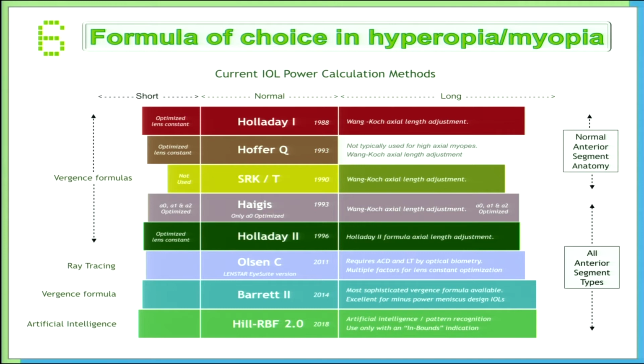So coming to the most important question, for routine hyperopia, high hyperopes and high myopes, what do we do? There is a new classification of formulae where regression analysis formulae like SRK and SRK II are a little outdated. We have newer formulae like 2 variable, 3 variable, 5 variable. The 5 variable is Barrett Universal II, which is very good.